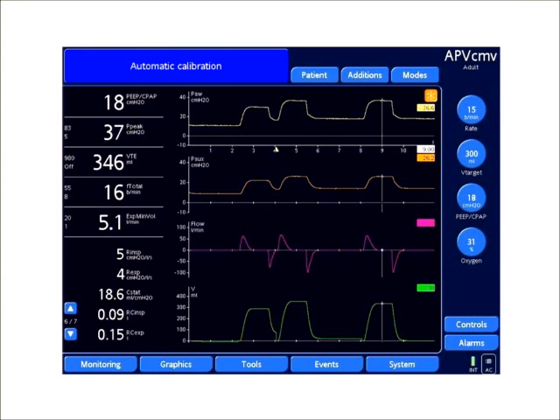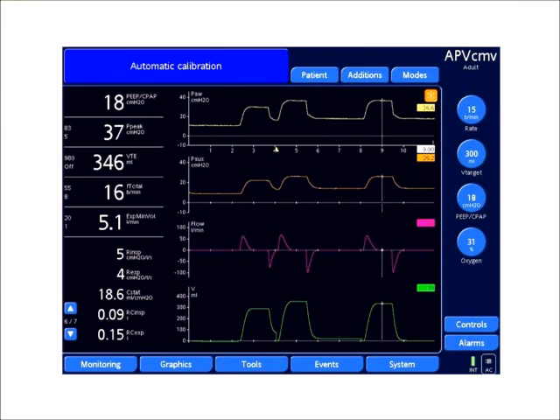You can use auxiliary pressure monitoring. This screen is an example of a Hamilton G5 ventilator where you can monitor esophageal pressures instead of having a stand-alone unit. This is also available on some bias ventilators.